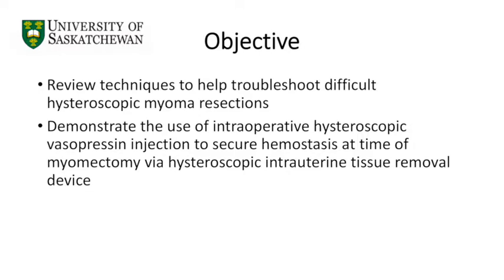The objective of this video is to review techniques to help troubleshoot difficult hysteroscopic myoma resections, and demonstrate the use of intraoperative hysteroscopic vasopressin injection to secure hemostasis at the time of myomectomy via hysteroscopic intrauterine tissue removal device.